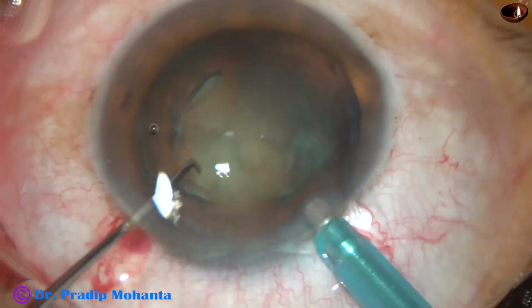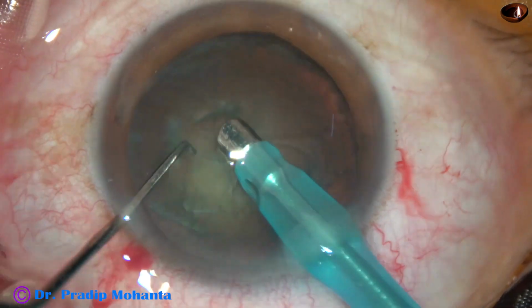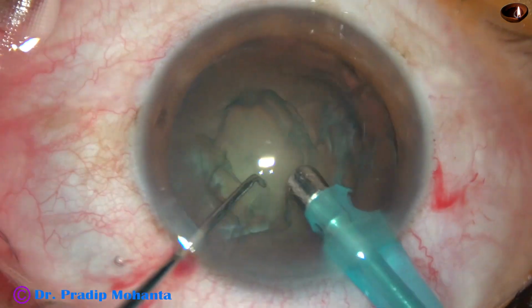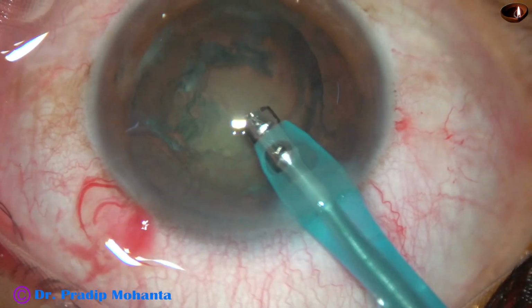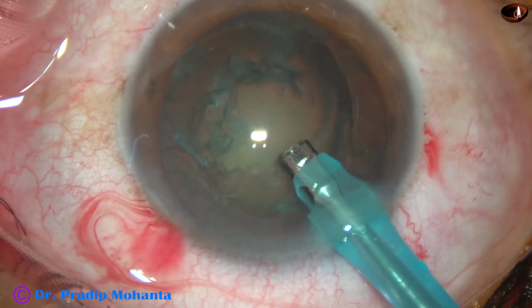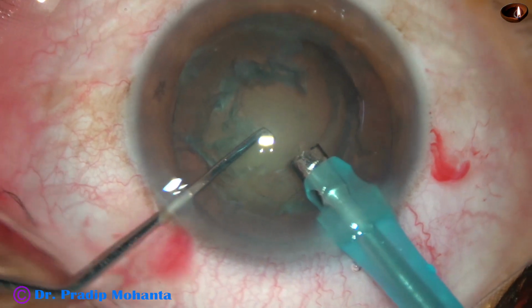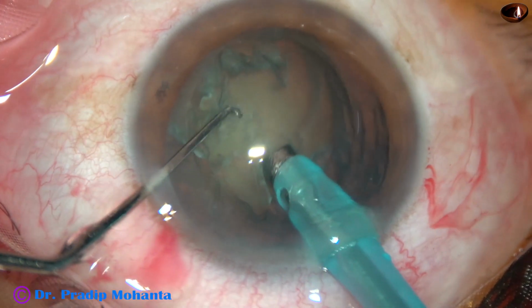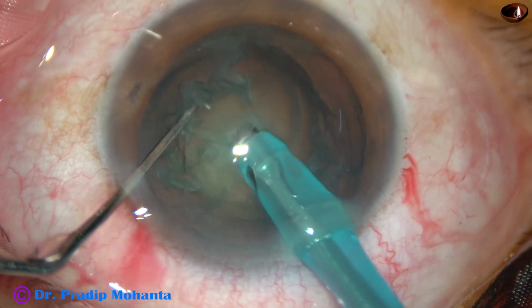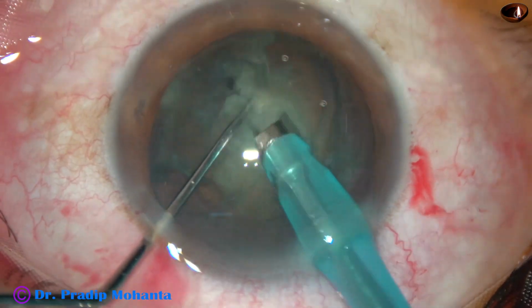The tip goes into the anterior chamber, bevel down. Some superficial cortical lens matter is aspirated. The handpiece is turned, bevel is up, and now this is direct chop. I bury the tip into the substance of the nucleus, hold the nucleus very firmly, and then chop it.